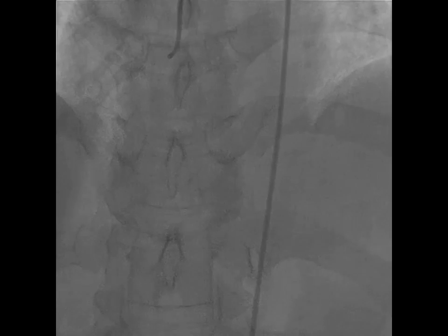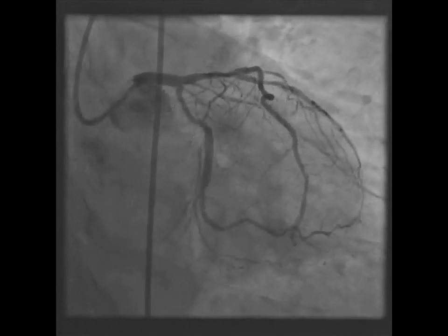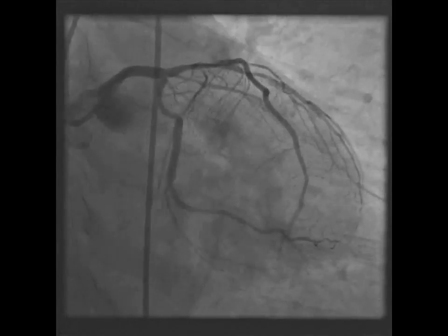Angiography of the right coronary artery shows mild disease in the mid-RCA. It is a dominant vessel, and you notice there's a focal moderate to severe 60% stenosis in the right posterior lateral branch. I proceeded with intervening on his mid-left circumflex artery with placement of a 3.5 by 16 millimeter drug-eluting stent and achieved a nice result, as you see here.